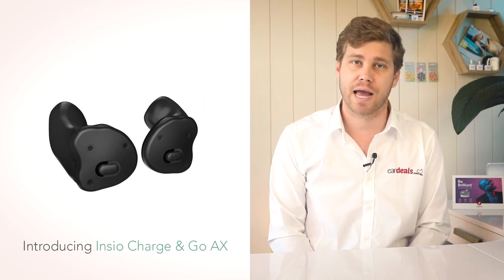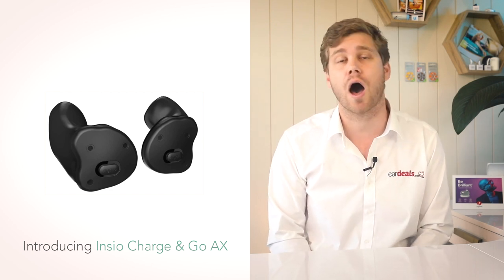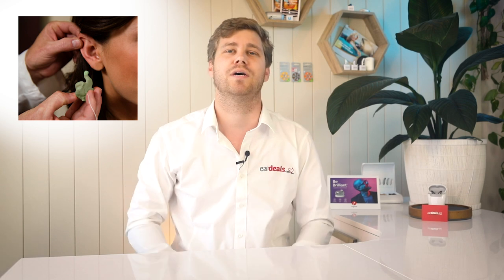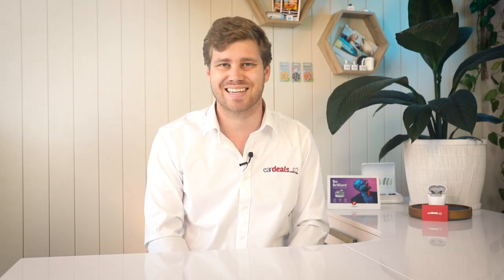Custom made hearing aids within the industry are highly popular. A mould is taken of your ear canal by an audiologist, then a hearing aid is placed inside that shell. The outcome is a highly discreet hearing aid that sits comfortably in your ear canal, often marketed as invisible.